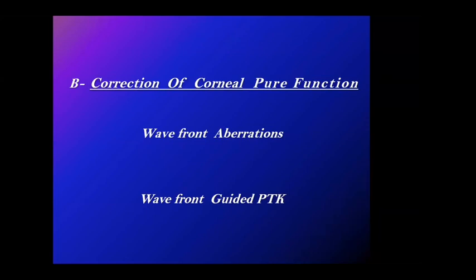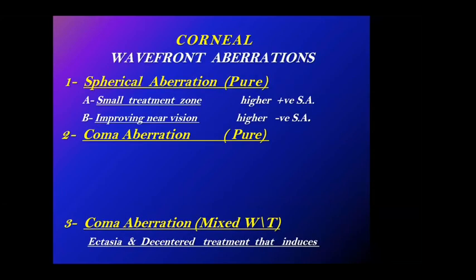Now we said PTK is not customized. It is just PTK. Okay? Now let us talk about the pure morphological shape, and now about pure function. Here, with wavefront pathology, we have to treat with wavefront guided PTK. The wavefront aberrations, for us, are either pure spherical aberration, pure coma aberration, or mixed wavefront and topography. So both of them are affected.